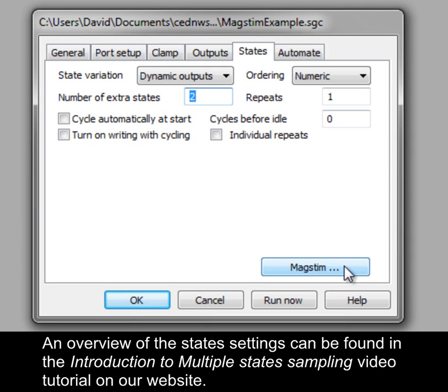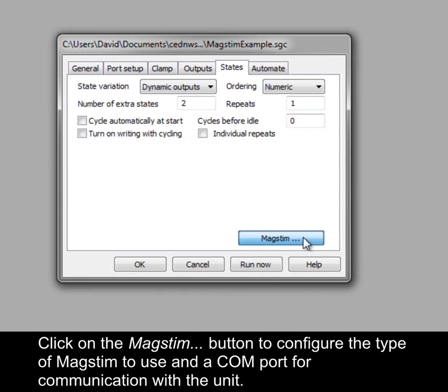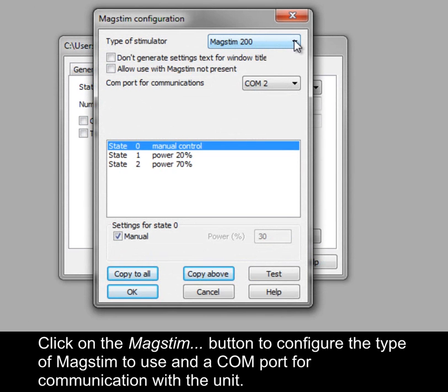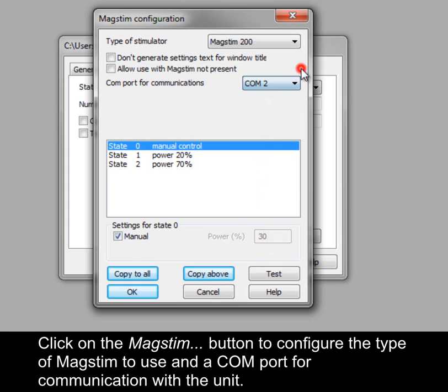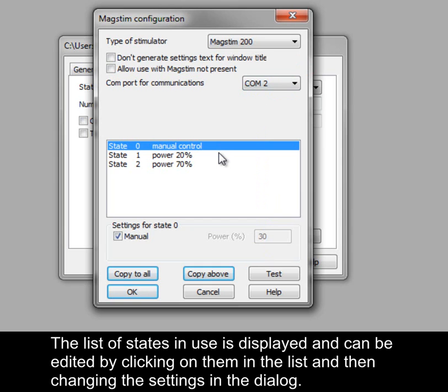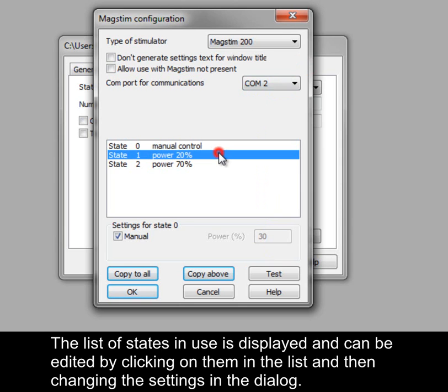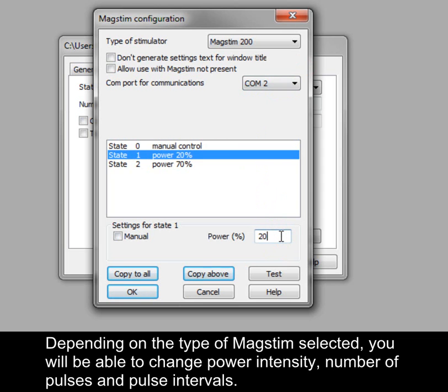An overview of the states settings can be found in the Introduction to Multiple States Sampling video tutorial on our website. Click on the MagStim button to configure the type of MagStim to use and a COM port for communication with the unit. The list of states in use is displayed and can be edited by clicking on them in the list and then changing the settings in the dialog. Depending on the type of MagStim selected, you will be able to change power intensity, number of pulses and pulse intervals.